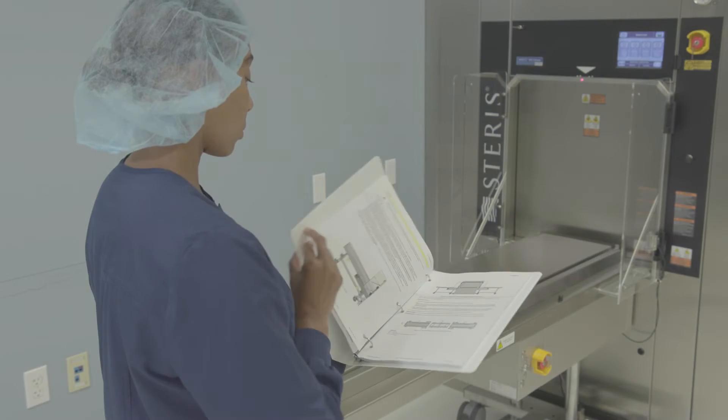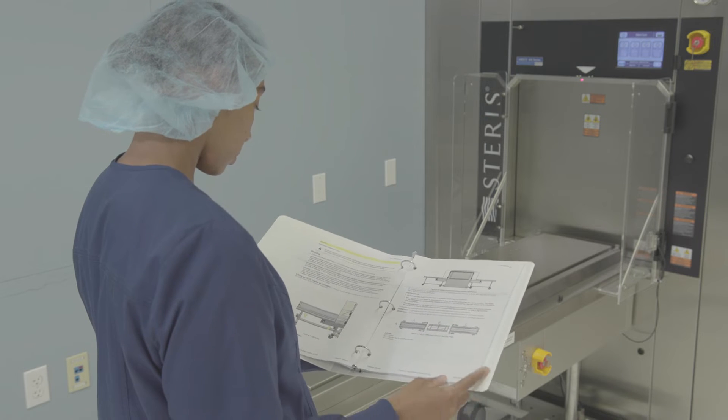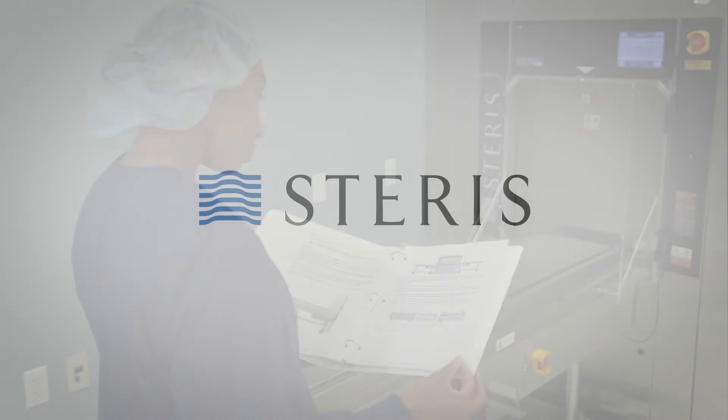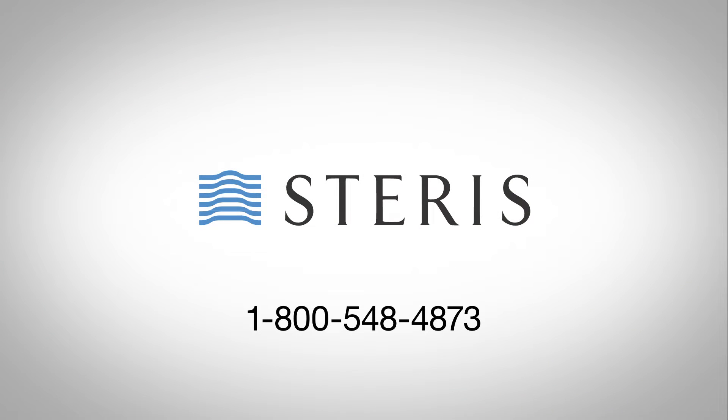Prior to watching this video, please read the A-LIS installation, operator and maintenance manual, section six. If you are unclear about anything contained in the manual or this video program, contact STERIS.